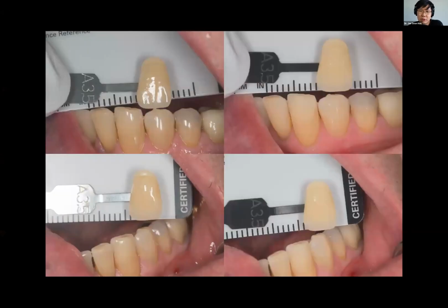Now, for posterior teeth, a lot of the time patients can't retract very well, or they just don't open as much. So it's really hard to get a perpendicular angle to the gray card. On the top, you see, I try to get as perpendicular as possible. But sometimes, if it's a second molar or something, I actually turn it so that I'm looking at it from the front view, because for the crowns, you're not really looking at it from the buccal view, but from the front.